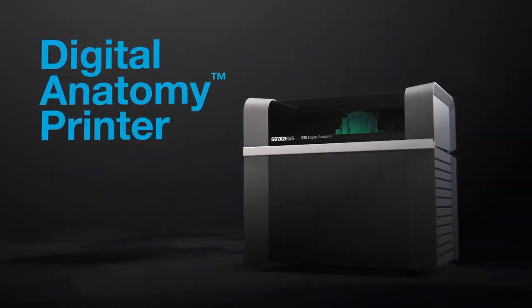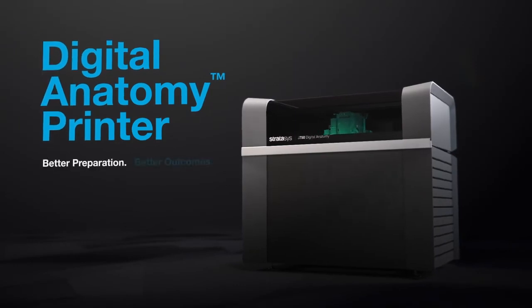Digital anatomy printing technology. Better preparation, better outcomes.